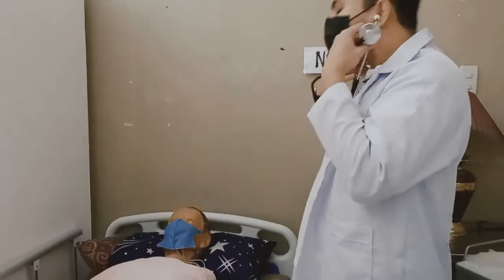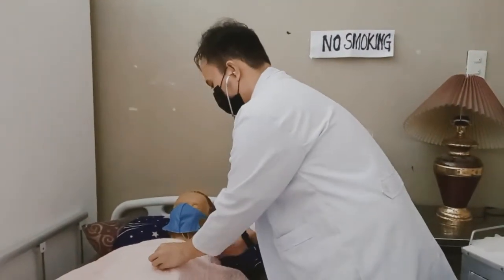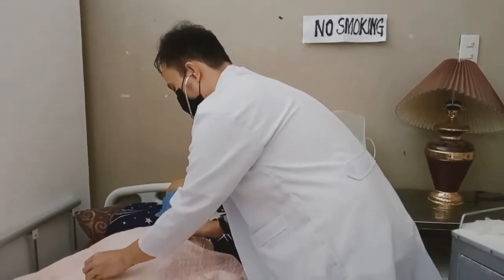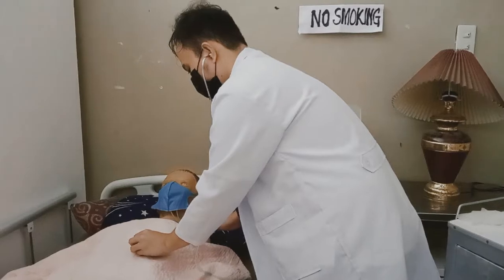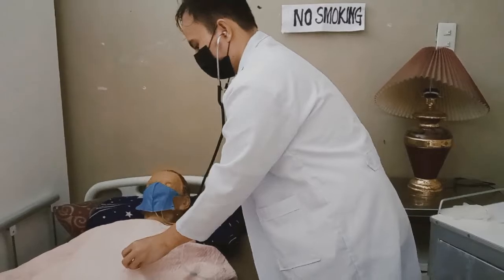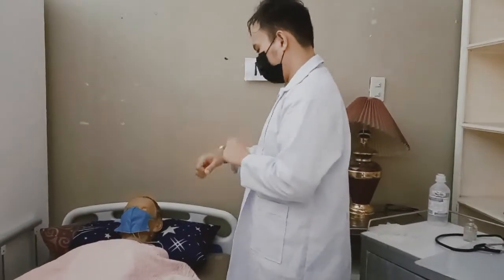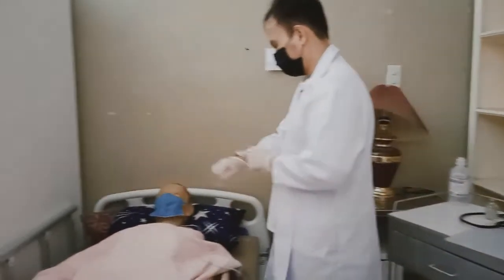Instruct the patient to inhale slowly and deeply through the mouth. A nose clip may be necessary if the patient is also breathing through the nose. Hold each breath for a slight pause before exhaling. Continue this inhalation technique until the medication in the nebulizer cup has been aerosolized, which usually takes about 15 minutes, when the mist decreases.